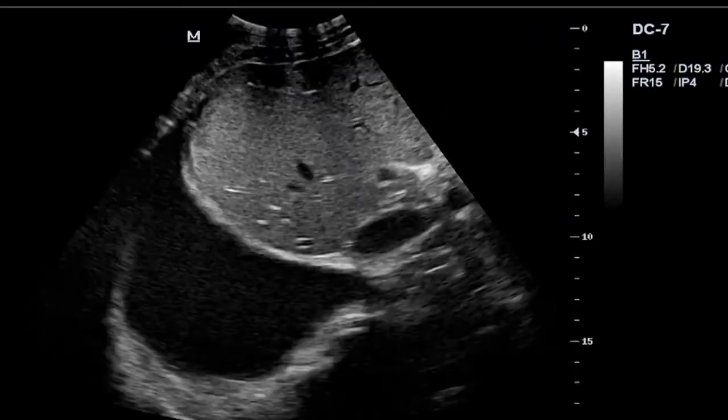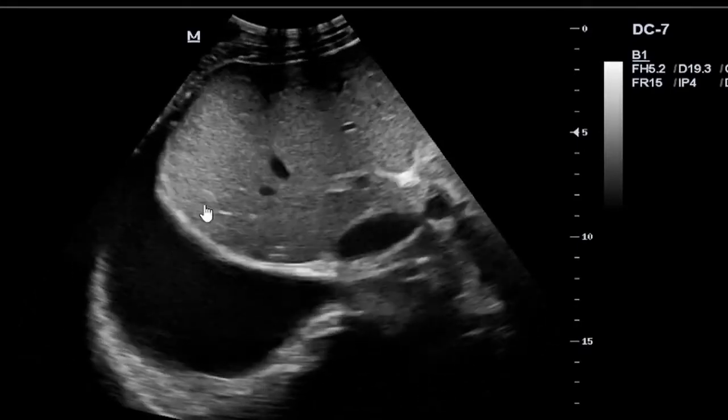The same patient also had, coincidentally, what is called a pleural effusion. That's the pleural space. This is our diaphragm, and here is our liver, our gallbladder, and this is part of the pleura, and you will see there is free fluid here, and this now is what is called a pleural effusion.